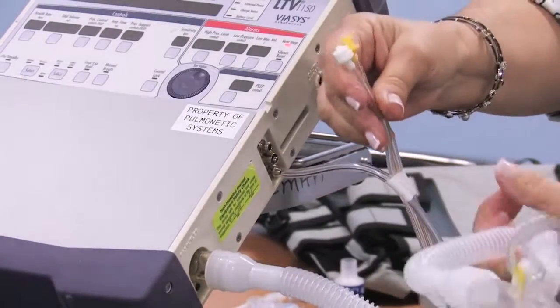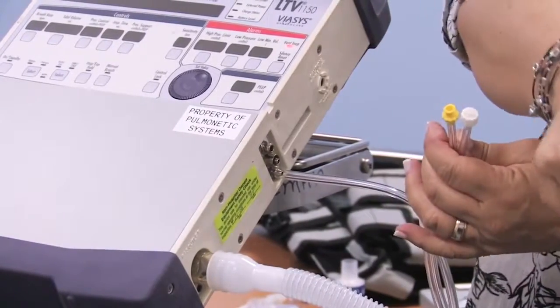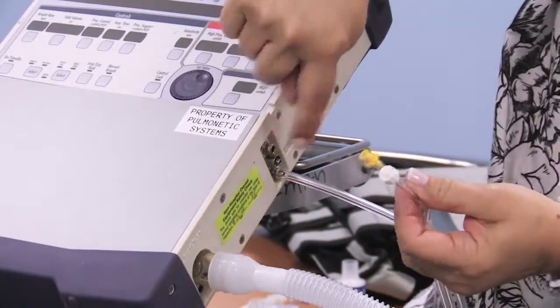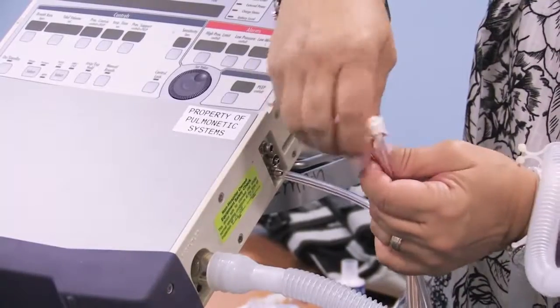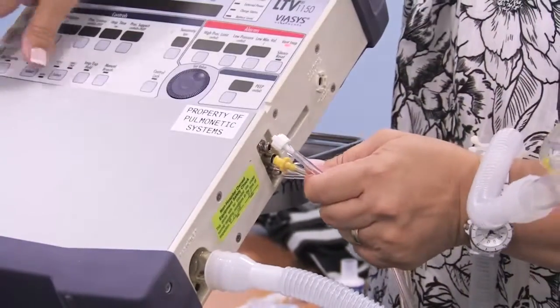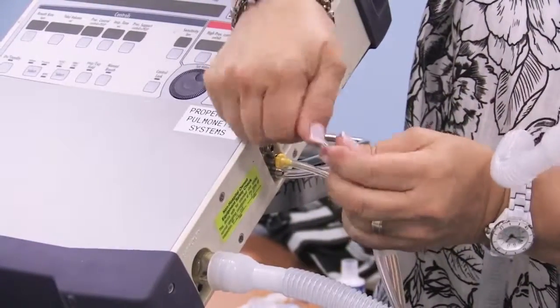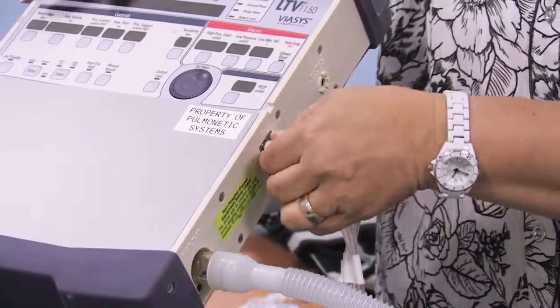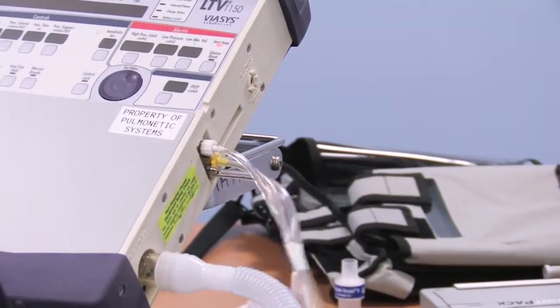And then we have our other two pieces, which are the brains of the machine, which send feedback from up near your child's tracheostomy tube back to the machine, color-coded yellow for the middle one. We talked about turning it backwards or counterclockwise so that when you connect it, it wants to go forward, and just give it a little tighten. And these will look at the child's breathing rate, measure the amount of air they're receiving.